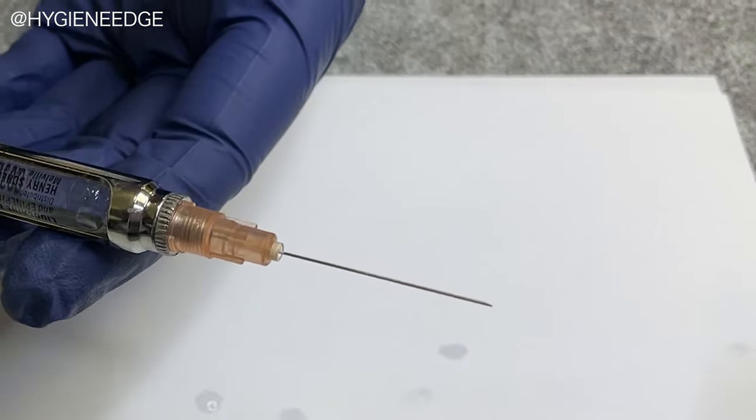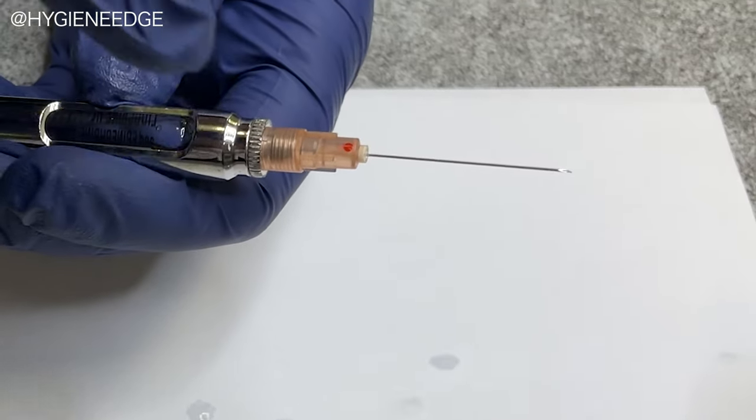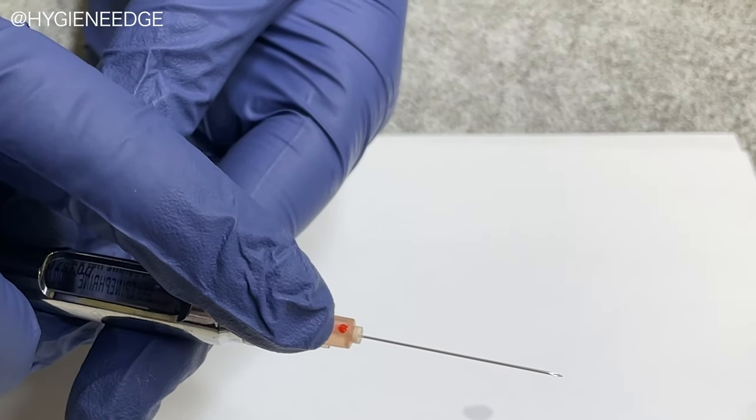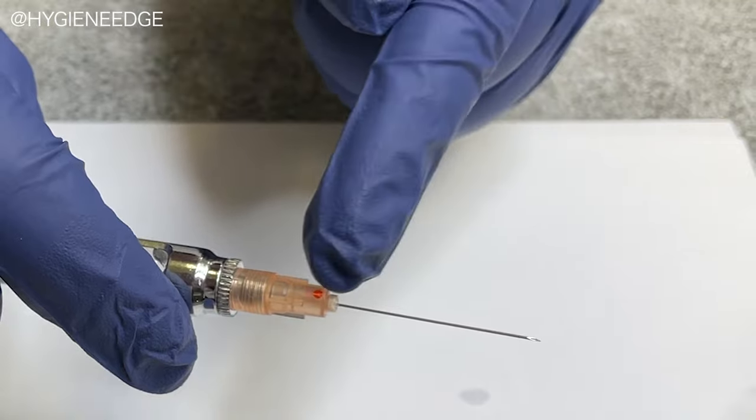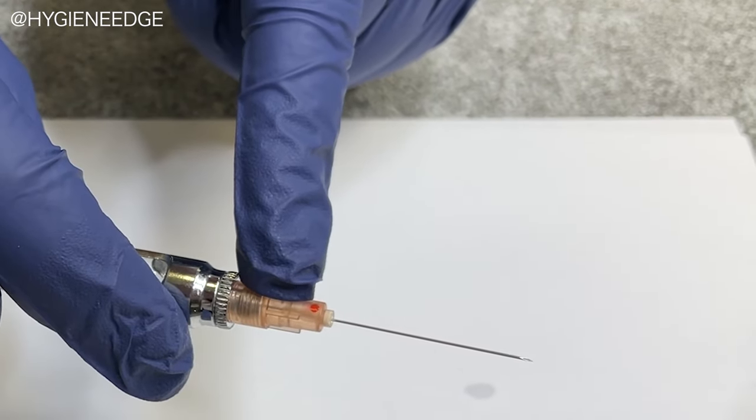One little helpful thing to know where the bevel is, depends on the brand. But if you look at your needle, it'll have a little mark. And the bevel, the opening, is lined up with that mark on the hub.